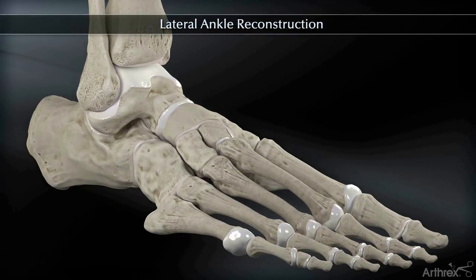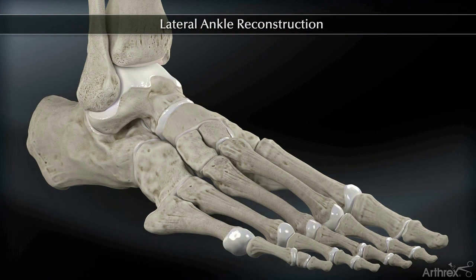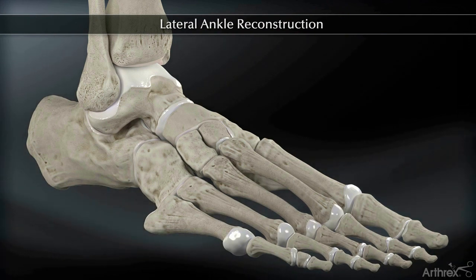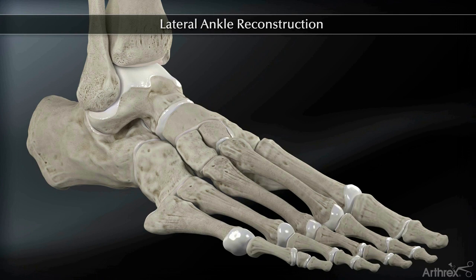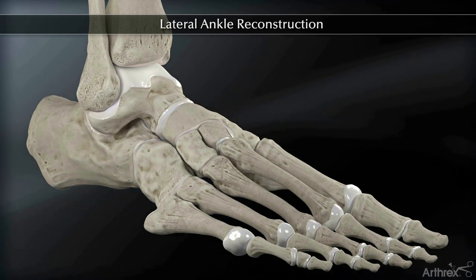The Arthrex lateral ankle reconstruction technique with the pre-sutured lateral ankle tendon is ideal for continued laxity of the anterior talofibular (ATFL) and calcaneofibular (CFL) ligaments. This reconstruction technique provides stable fixation of the ATFL and CFL using Arthrex tenodesis screw technology.